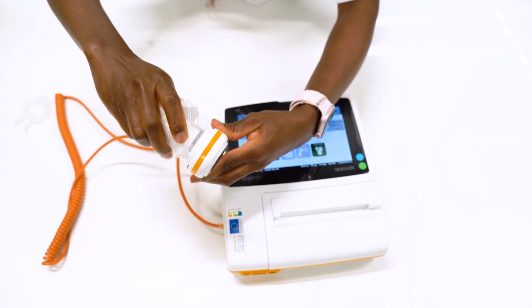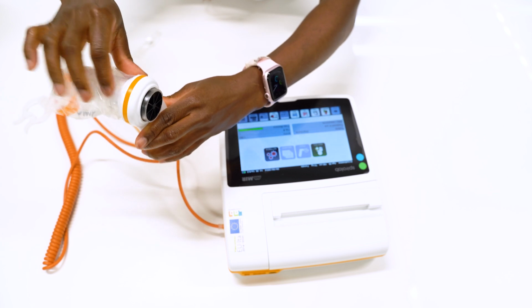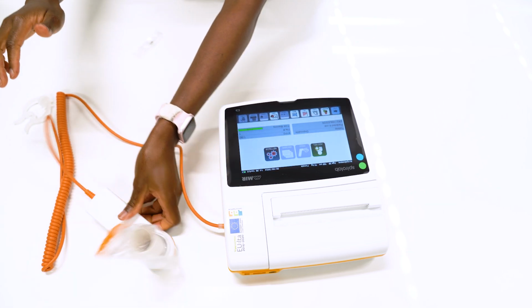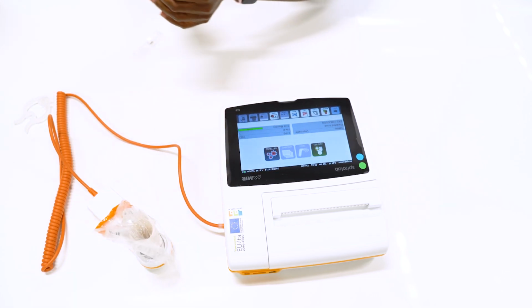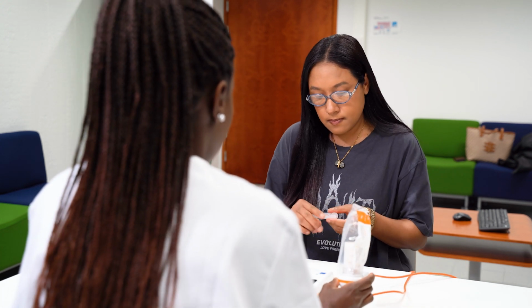The turbine should fully slide into position in the mini flow meter, turned clockwise until it clicks into place. Connect the mini flow meter to the Spirolab. Now the patient sits comfortably. Before placing the mouthpiece in the mouth, the patient should breathe normally.